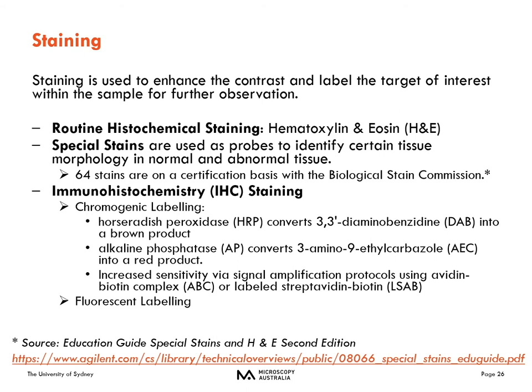For chromogenic labeling, signal amplification techniques can be used to enhance the sensitivity. You can use the avidin-biotin complex method or the labeled streptavidin-biotin method. And later we'll talk a bit more about fluorescent labeling.